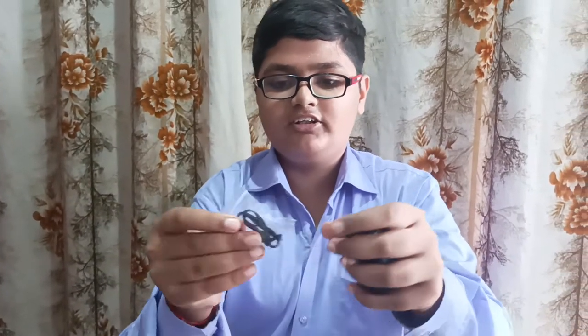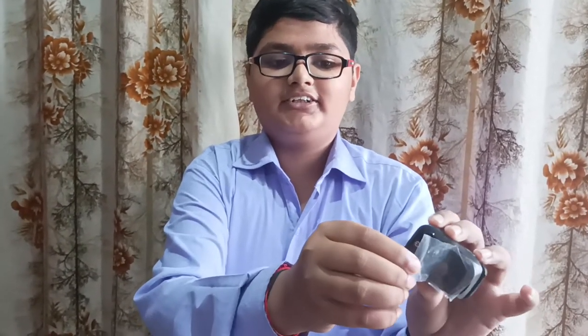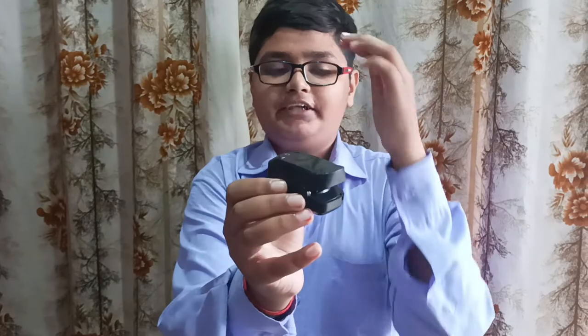As we can see in the box, we have one strap, the device, and a user manual. It's stuck inside so I cannot take it off — so let's open this. As we can see, we have to put a finger inside this, and it works on AAA battery.